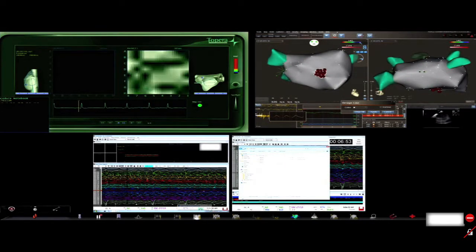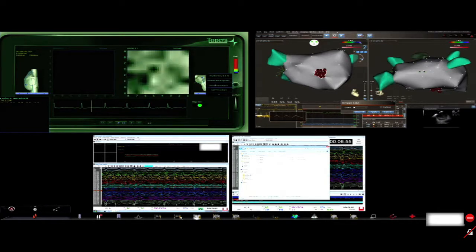Dave, my question is, have you found the RAP information to be very helpful? You've not shown us that. I think it was actually up there on the previous map, but I'll show it again. We're processing now the new map, and I'll show you that in 1 minute. Okay.